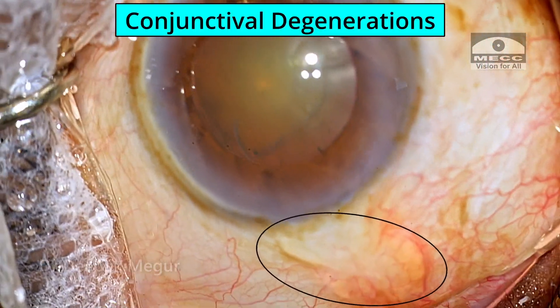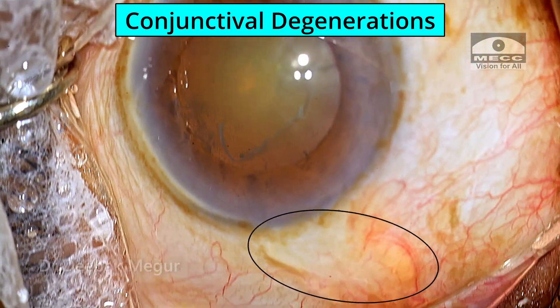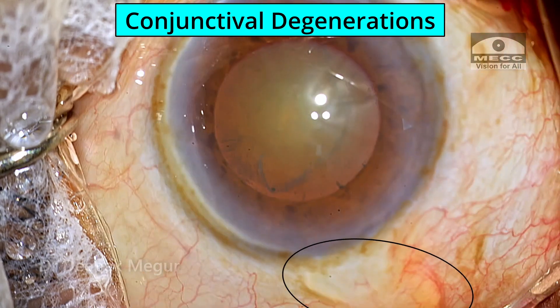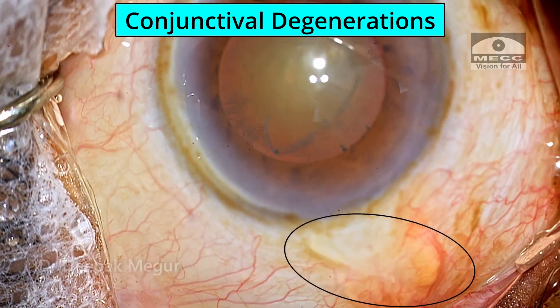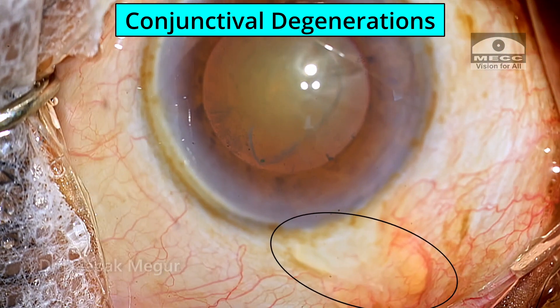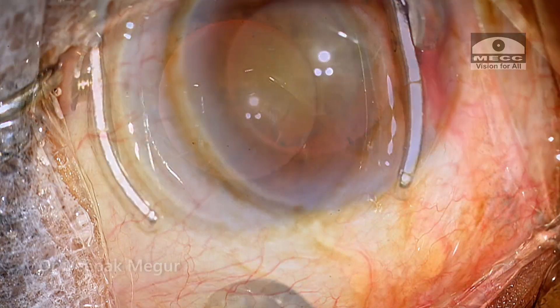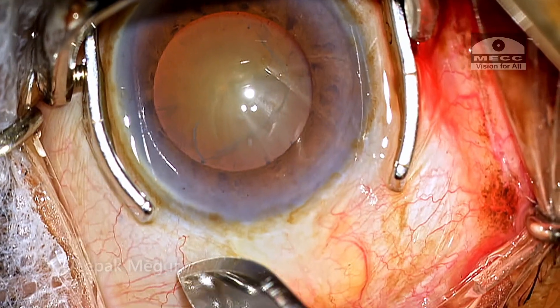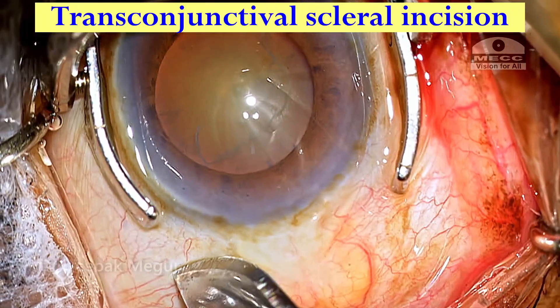The temporal conjunctiva usually will have these degenerations near the limbus which will heap up when we suture back the conjunctival flap later, leading to some sort of a dellen formation. To address this issue, I am going to use a trans-conjunctival scleral incision.